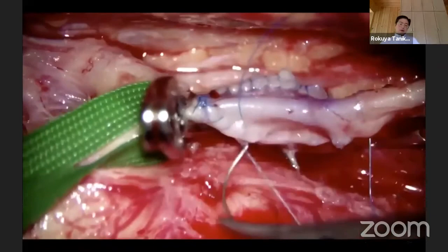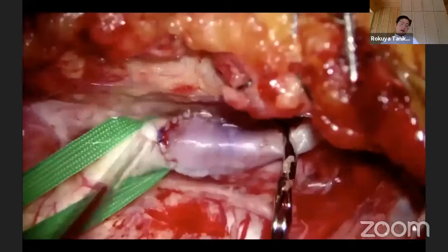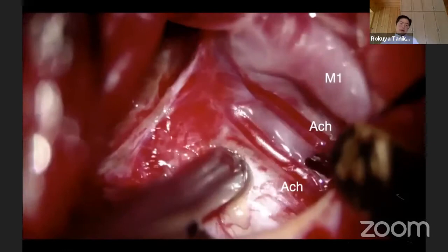This is a 7-0 Pronova with a running suture. Then the cervical ICA is clamped, then the radial artery is opened. Now blood flow is provided to the brain through the radial artery graft from the external carotid to the middle cerebral artery. I am confirming the anterior choroidal artery is patent by the high-flow bypass.